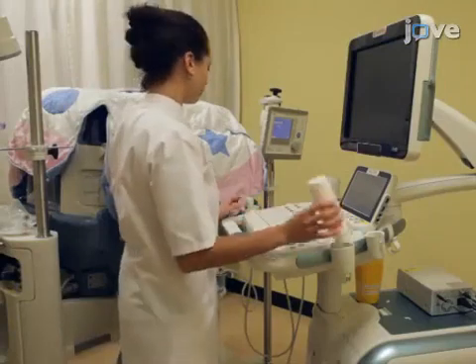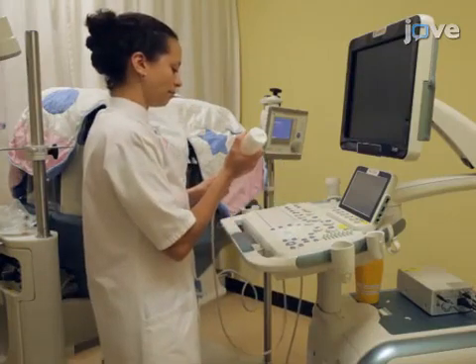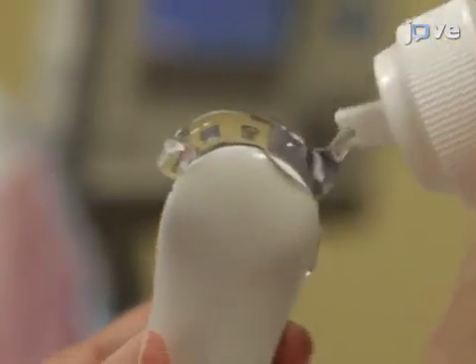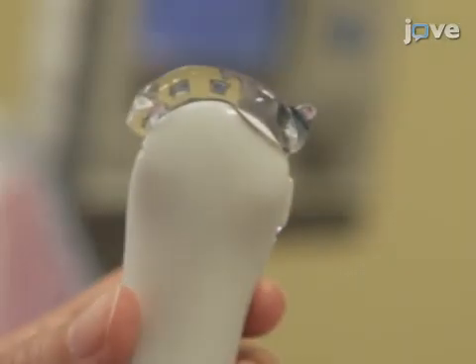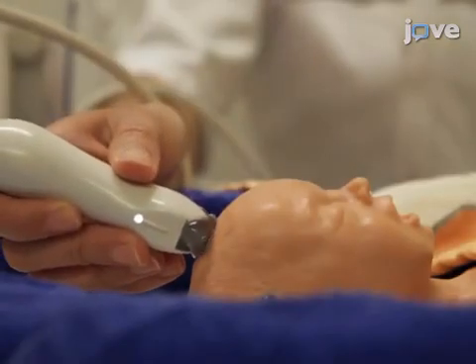Before beginning the procedure, install the ultrasound machine along the incubator, and then apply transducer gel to the probe to ensure good contact between the probe and the skin. When the instrument is ready, place a probe in B-mode in the middle of the anterior fontanelle, with the marker on the probe turned to the right side of the neonate.